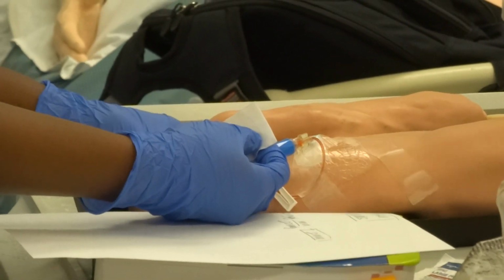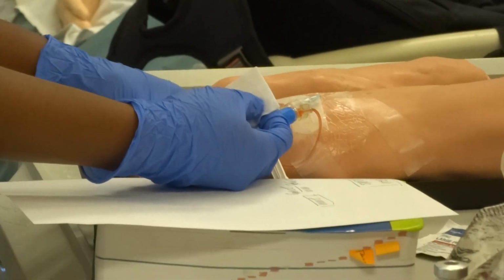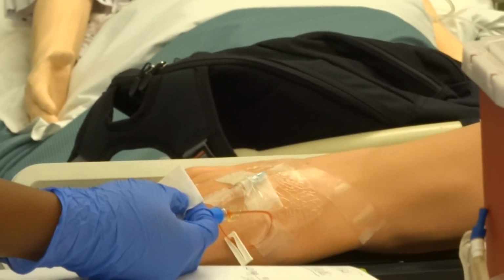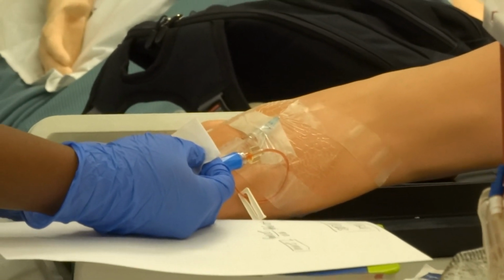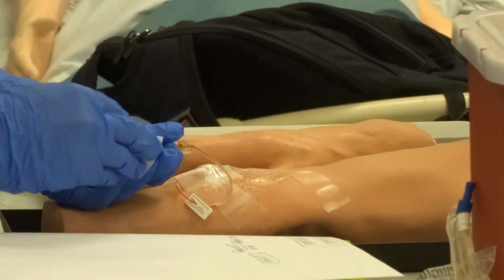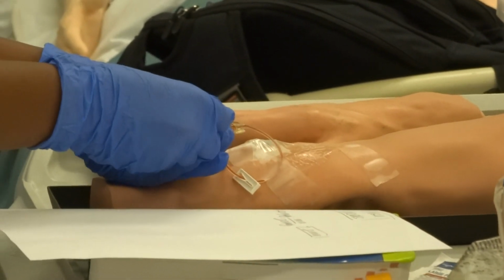By assessing it, you can kind of tell, in a hospitalized patient, would this be a good or a bad IV? What do you guys think? Bad. Bad, because it's coming out. But you don't know that for sure yet, right? You can try to flush it and see if it's still flushing.